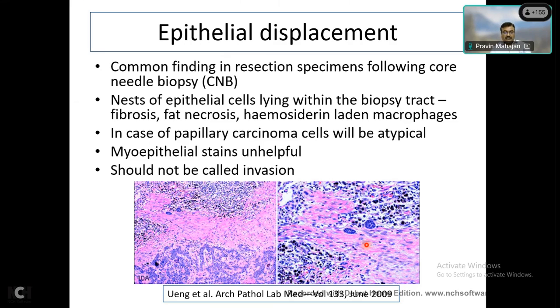then this is most likely epithelial displacement rather than an invasive tumor. In such a scenario, myoepithelial stains are not useful. So do not attempt to do the myoepithelial cell stain, because those will be negative and you might falsely interpret it as an invasive tumor.